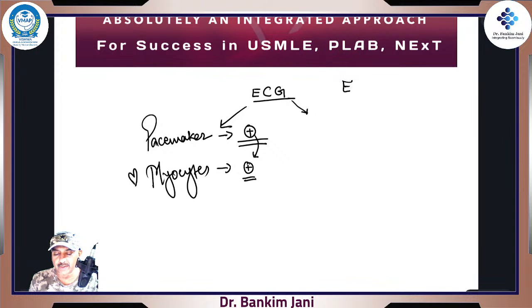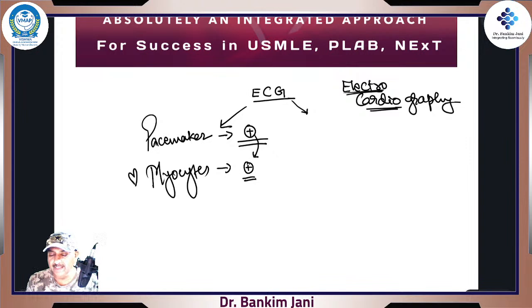When we say electrocardiogram or electrocardiography, this is a language. This is a written language of the heart. So this language tells how the heart is functioning, and it will tell about almost all the chambers, right? It will also tell about how the current is going.